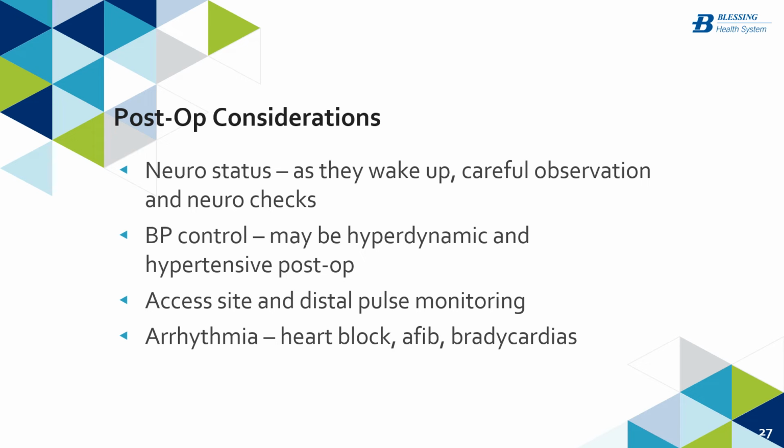Monitoring their access sites and distal pulse monitoring. The large bore access site, we do use a 14 French or an 18 French sheath, and then we'll use a vascular access closure device, so either Manta or Perclose, or if we've done a femoral cut down, it'll be surgically closed. So watch for any hematoma, drainage, bleeding, and then watching for distal pulses, color, temperature. Hopefully that's been marked pre-op, and as you're passing off your assessment and report of the patient, you'll also look at that pulse together and make sure that everything's as it should be, and then just keep watching that.